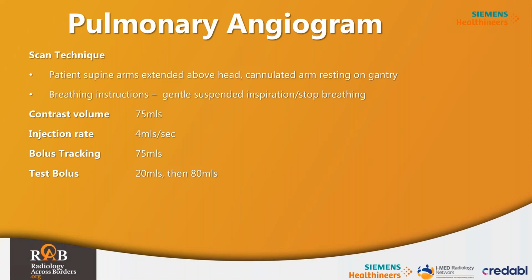So we're going to go supine, arms above head again. Breathing instructions really important for this one so they don't Valsalva. Generally, we either want a gentle suspended inspiration or a stop breathing. I prefer the stop breathing. It's really important to explain this to the patient.